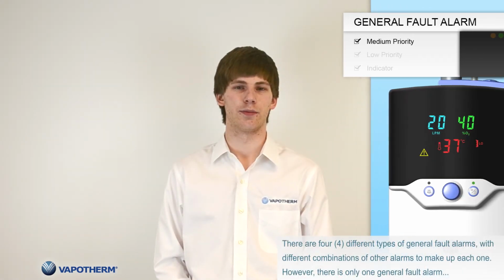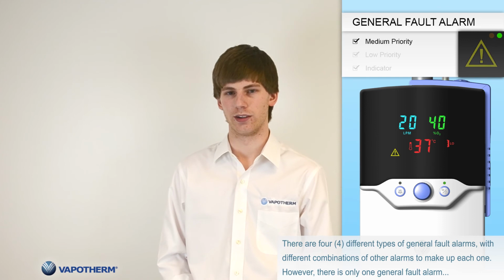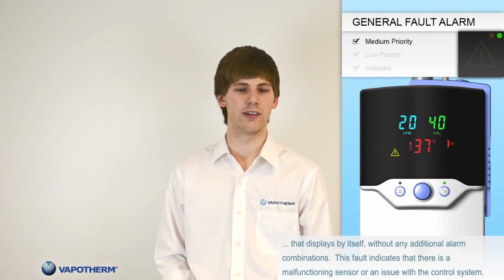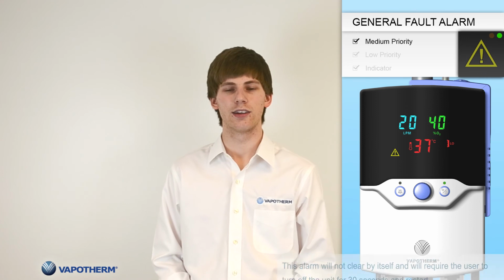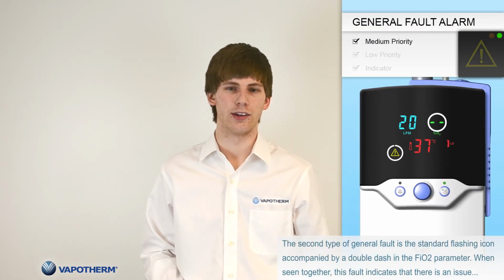There are 4 different types of general fault alarms, with different combinations of other alarms to make up each one. However, there is only one general fault alarm that displays by itself without any additional alarm combinations. This fault indicates that there is a malfunctioning sensor or an issue with the control system. This alarm will not clear by itself and will require the user to turn off the unit for 30 seconds and restart.